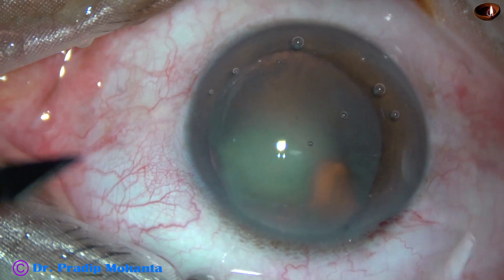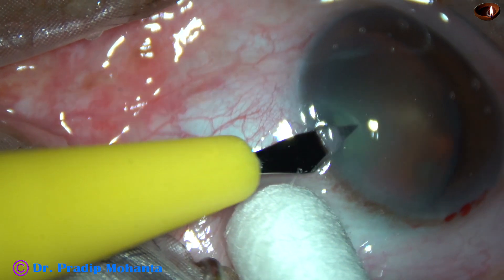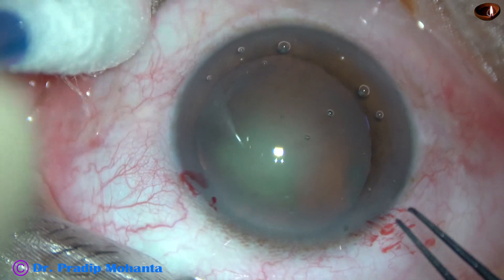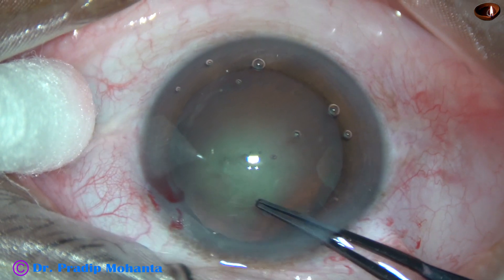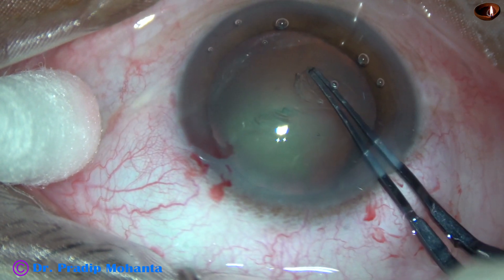This is a side port on the left side of the main incision, about three clock hours away. In this case I have made only one side port. And now capsulorhexis is being done with the help of a Utrata forceps.